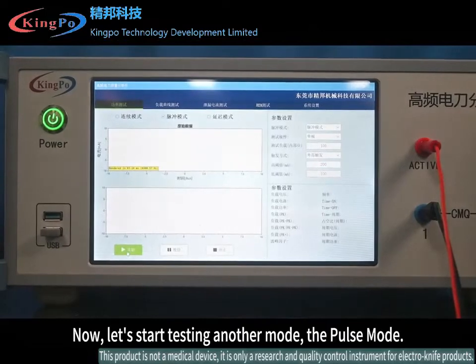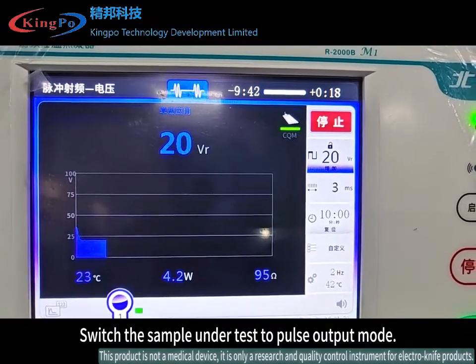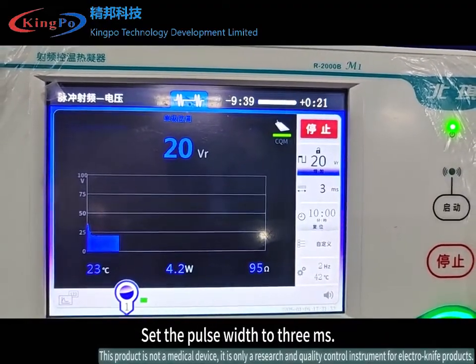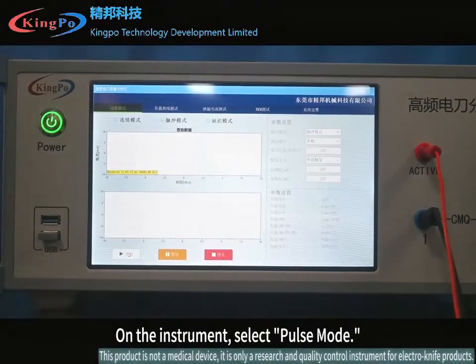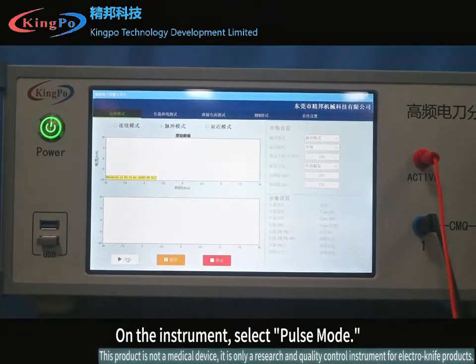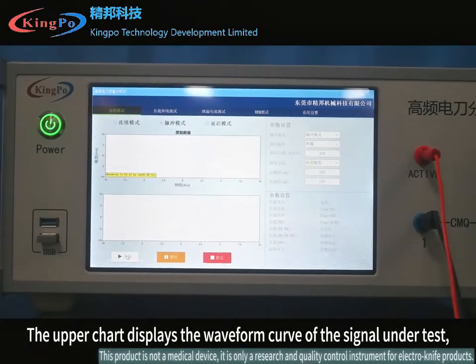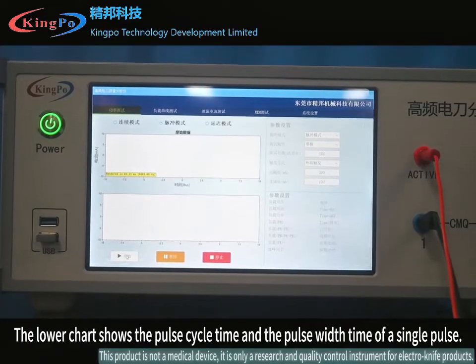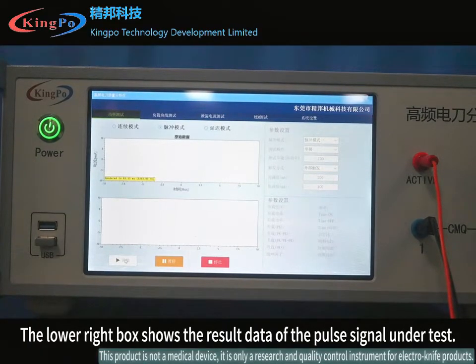Click stop to end the test. Now let's start testing another mode: the pulse mode. Switch the sample under test to pulse output mode, set the output power to 40W, set the pulse width to 3 ms, and click start to output power. On the instrument, select pulse mode. There are two charts here. The upper chart displays the waveform curve of the signal under test, which is a pulse signal. The lower chart shows the pulse cycle time and the pulse width time of a single pulse.